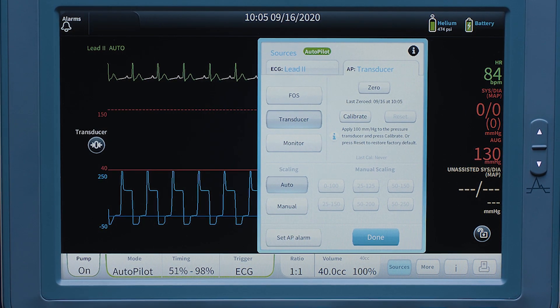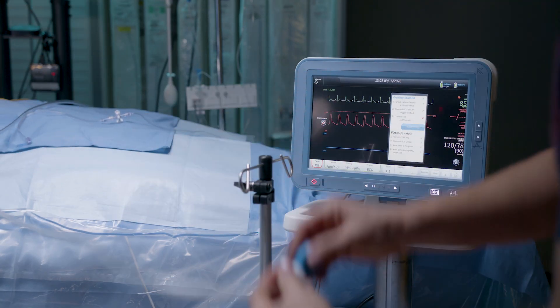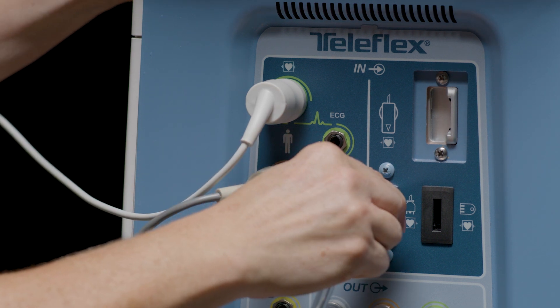The final connection will be the IAB gas drive tubing. The scrub person will hand off the IAB gas drive tubing to the circulating person to connect to the pump, once the IAB has been inserted into the patient and its position has been verified. Connect the balloon connector to the pump.